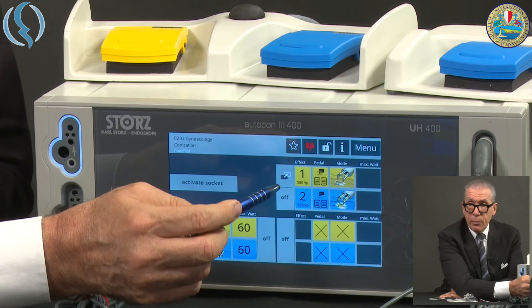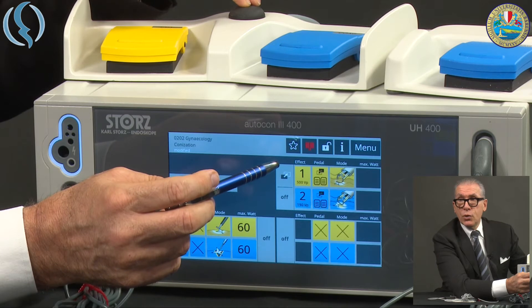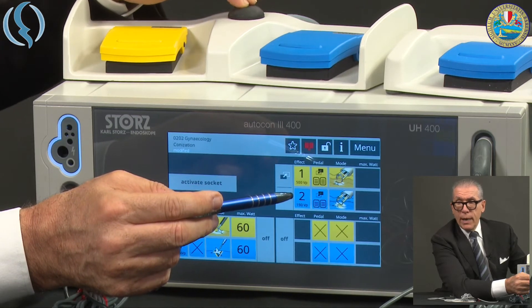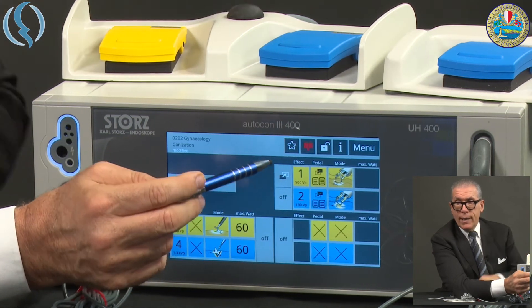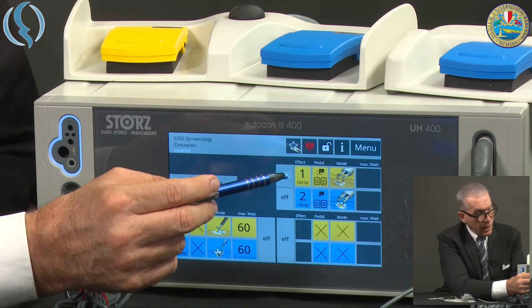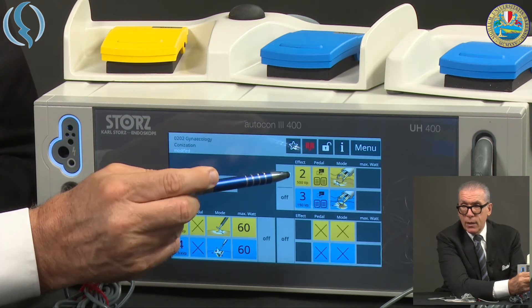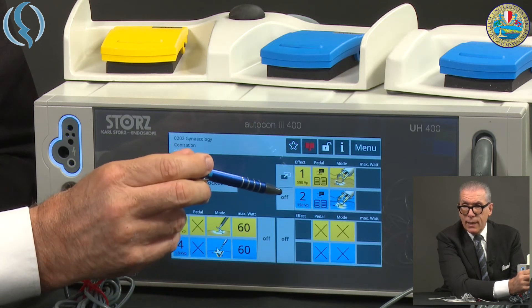So instead of the previous settings, I now have one and two. This means that as soon as I push the button on the pedal, I switch between the standard mode two-three, or back to my custom mode one-two. This can also be done by the OR team by clicking this icon. You see it becomes white for the standard setting and black for my custom option, so I can switch between them.